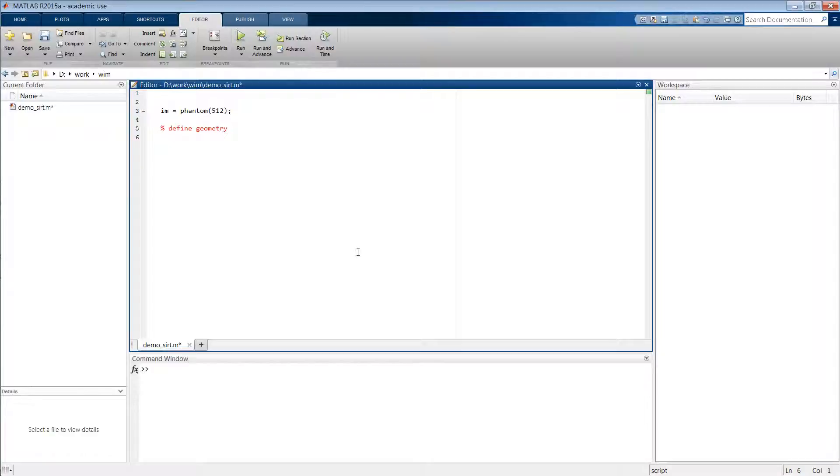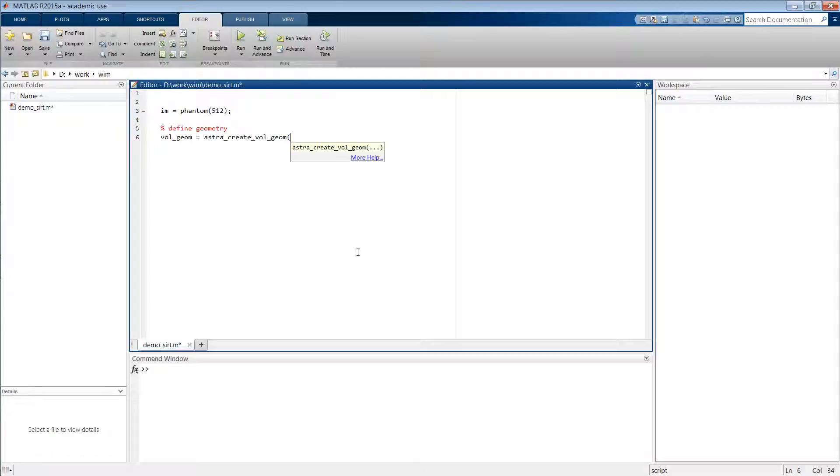There are two types of geometries. We have the volume geometry, which we configure by typing astra_create_vol_geom, and then we have to specify how many pixels there are in the volume. So in this case it's 512 by 512.